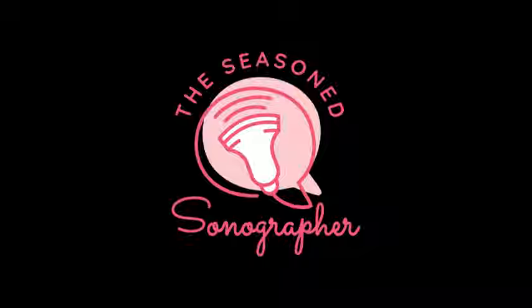Some optional biometry that can be used to detect skeletal dysplasia are the humerus length, the ulna and radius lengths, maybe tib-fib length. Those are all optional depending on if you suspect any problems with the skeleton. So how do we obtain these views? What are the proper anatomic landmarks?